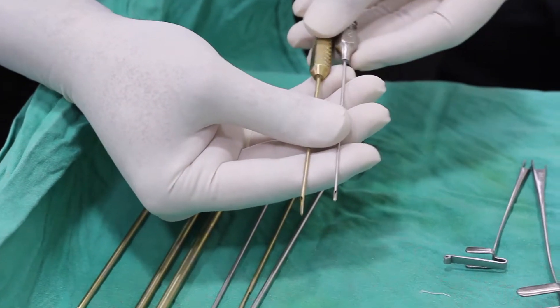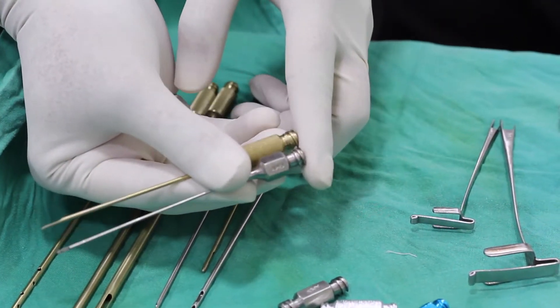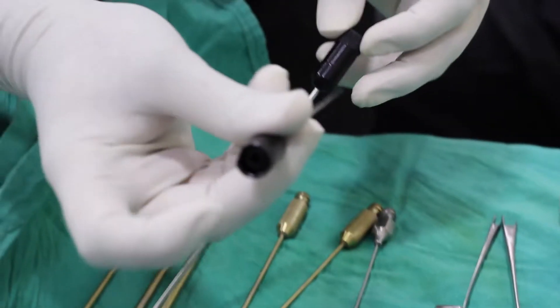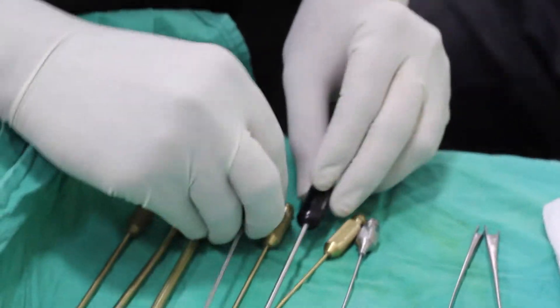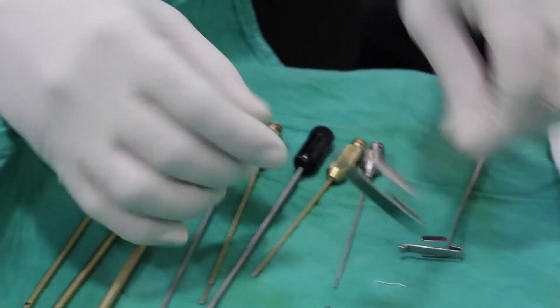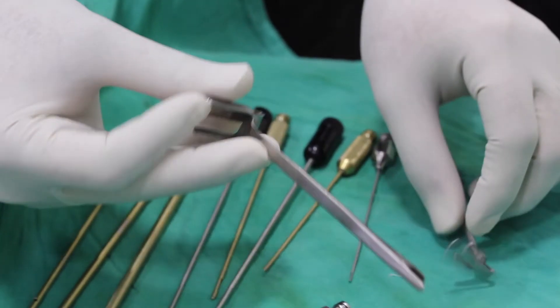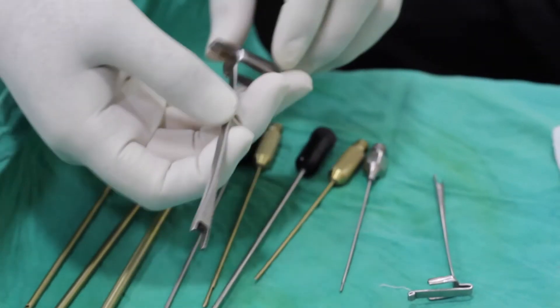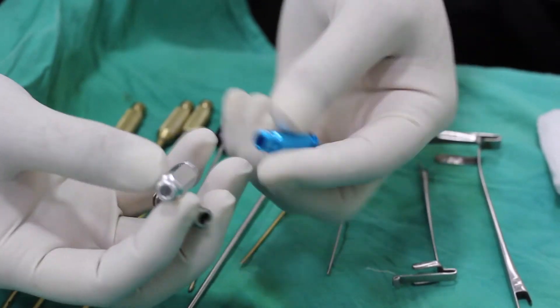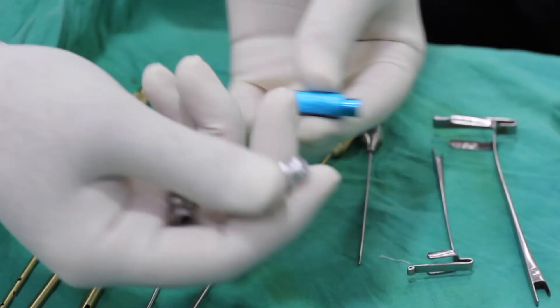These cannulas are injection cannulas which have an opening at the end — very thin and blunt — and they have a luer lock ending. These ones also have luer lock endings, easily available from various surgical providers. What we have here is a lock for the syringe: this is for the 50cc syringe and this is for the 20cc syringe, which will help us create pressure while extracting the fat. These are the transfer connectors which we attach to the luer of a syringe to transfer fat from one syringe to another.